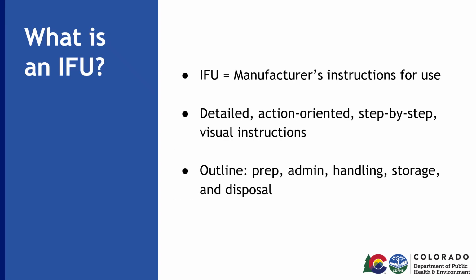Throughout this presentation, we'll refer to the instructions for use as IFU. IFUs are required instructions which provide detailed, action-oriented, step-by-step written and visual instructions for healthcare professionals on the intended use of medical devices and products. IFUs can include instructions for appropriate cleaning, disinfection, and sterilization of surgical tools and instruments, as well as the products that need to be used for these processes.